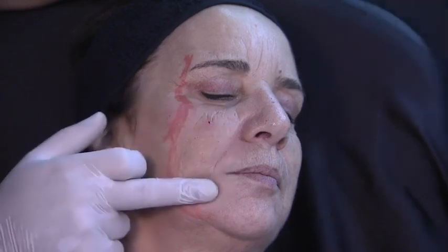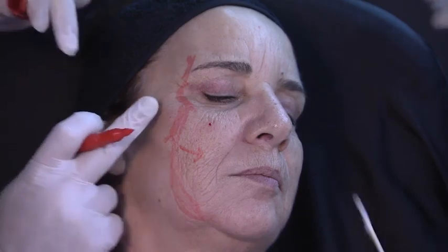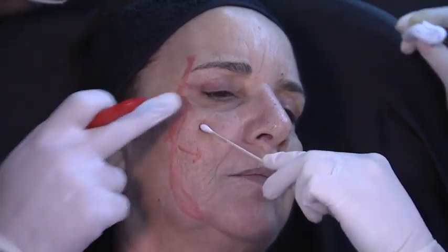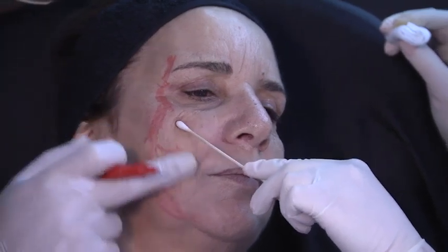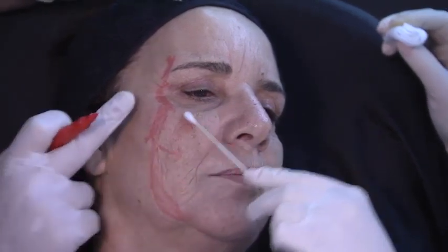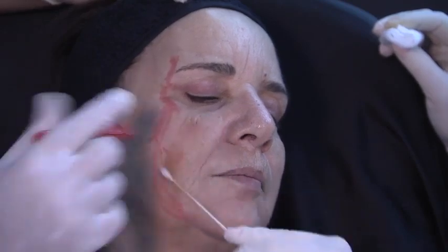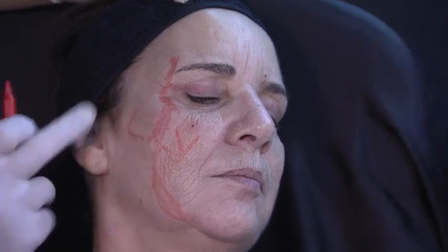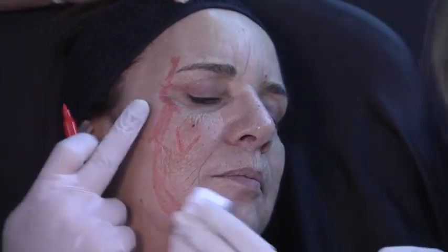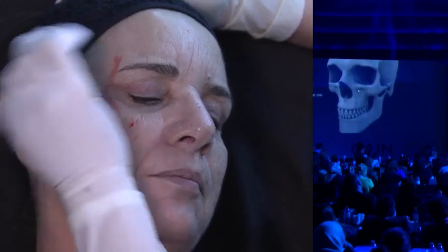Okay? But I can control this area with these attachments. So you need to see, if I inject a lot of product in this area, in the medial part, expecting a lifting effect, it's not correct because all the product will project the malar area or the cheek area, but I'm not having a lifting effect because there is the attachment of the ligaments. So this is a voluminization area, and all this is the lifting area. So when I really want to lift, the priority is all lateral.